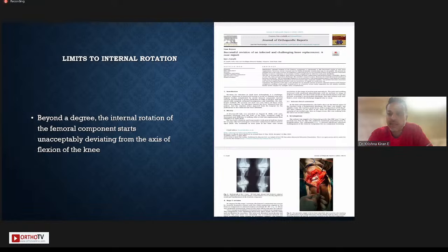So I personally believe that if we use the technology properly, subtle changes in flexion extension of the femoral component, adjustment of the tibial slope, rotation, and the coronal obliquity of the implant in line with the native obliquity within acceptable boundaries will make the operation much more elegant with much less need for soft tissue releases. That's been my observation over around 2000 cases now.